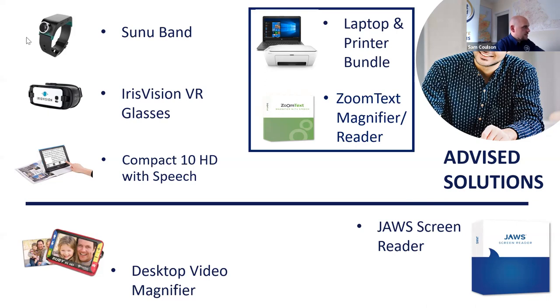People are discussing other programs they use, like Kurzweil 1000, which is a very good digital print access. Open Book is probably more up to date these days. Kurzweil 1000 hasn't been updated for about 12 years, but still does a good job. Open Book does the same, allows you to access digital print, and with a camera connected to it, allows you to access hard print to get it into a computer to be managed.